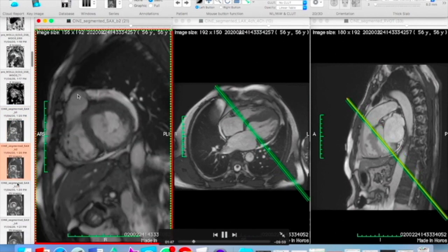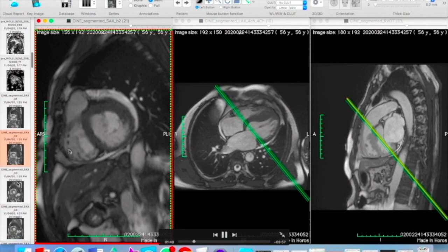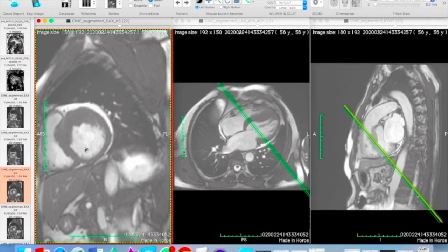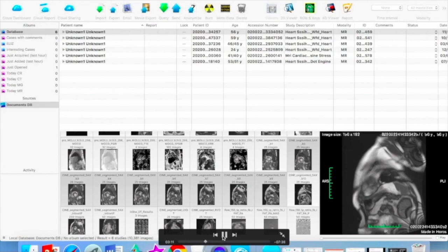So now in the next short axis CINE, the entire area is made up of RV, so that will be included. It is important to remember that the most basal and most apical CINE for LV and RV volumetry need not be the same, and this exercise is important to perform. Now we have identified the short axis CINE for LV and RV volumetry.